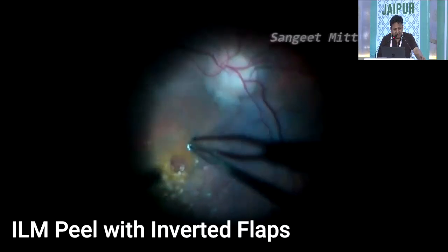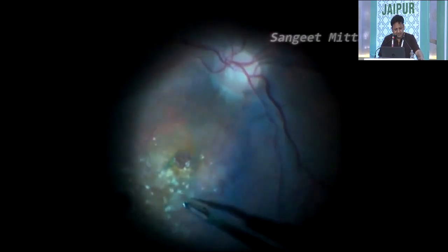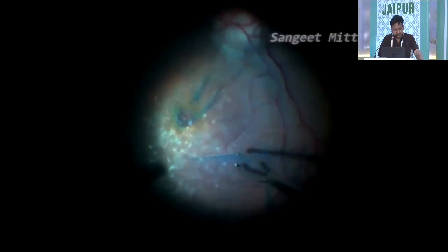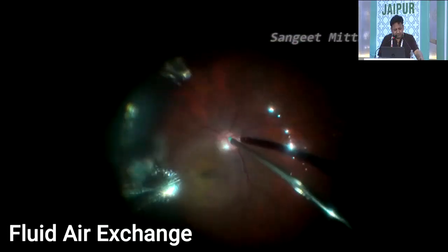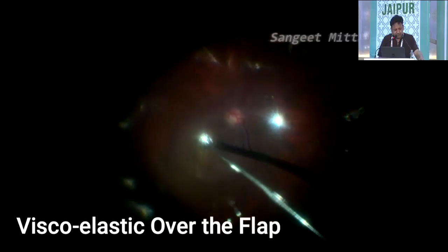In a case of AMD with coexisting full thickness macular hole, the ILM flaps were raised. Residual ILM was peeled. At this point, I was told that our PFCL stock is finished. Fluid air exchange was started and the eye was tilted to one side towards the optic disc so that the flaps can cover the hole. Once the macula was dry, the flaps were covered with dispersive viscoelastic Viscoat. Closure was done with air as tamponade. No post-operative positioning was advised.